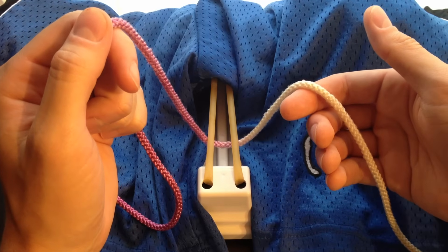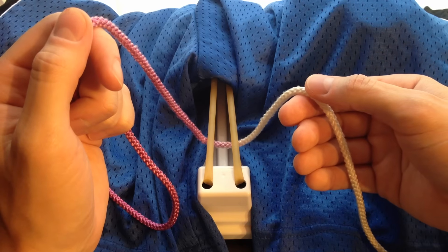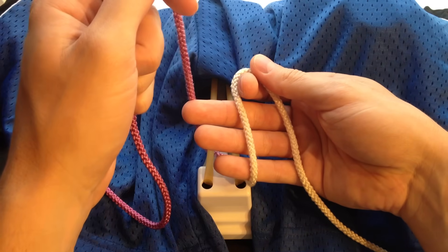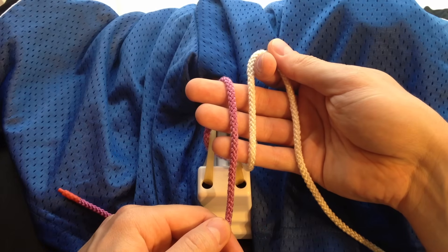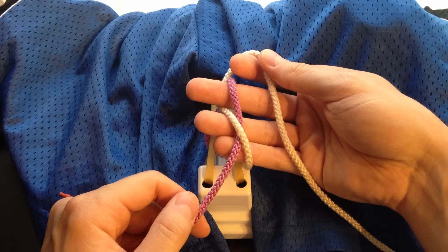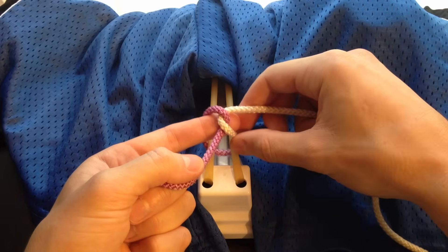To start, I like to have the thread draping across my palm. This first move I call the karate chop. You're going to pinch the string between your thumb and your pointer finger, open your hand, and karate chop the string, draping it over your three fingers. You're going to take the post and drape it over in the opposite direction. With your middle finger, you're going to go over the purple, under the white, and extend. You can see that you form a cross. With your middle finger and your ring finger, you're going to pinch the white string and pull it through the loop you created. And you can see that we've tied an overhand knot.